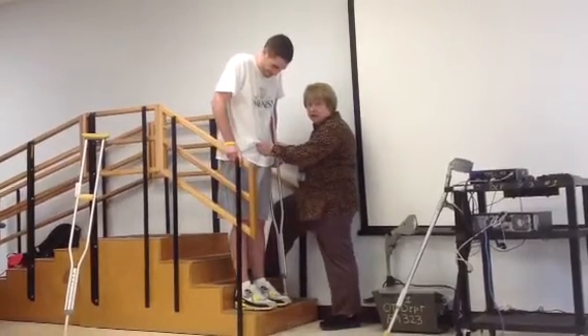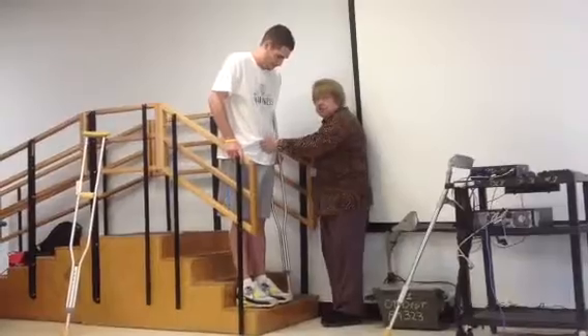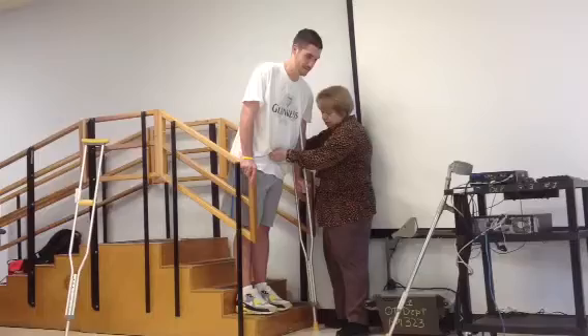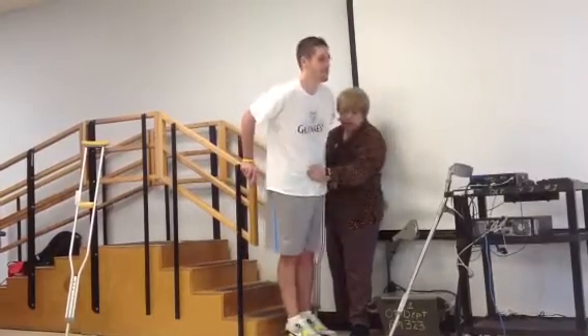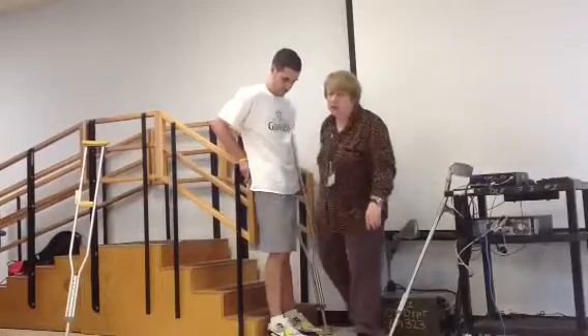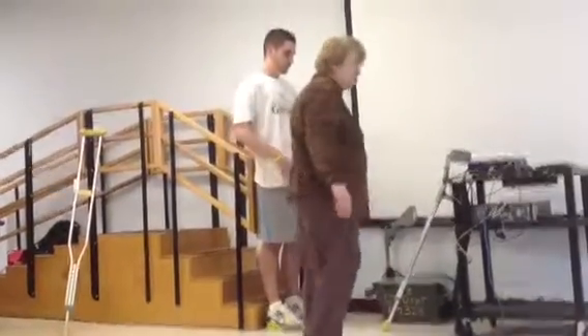Because I have to decide how much they're going to look up and how fast they get up, and then I would have the crutch ready for him to come — so that's essentially what I'm doing.